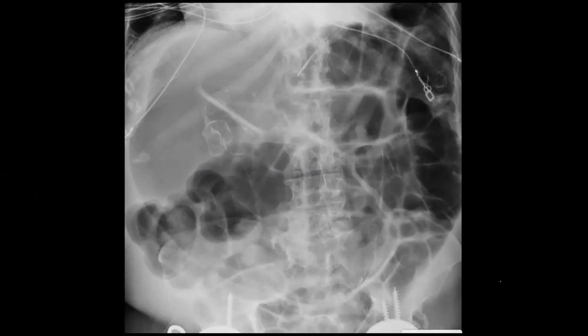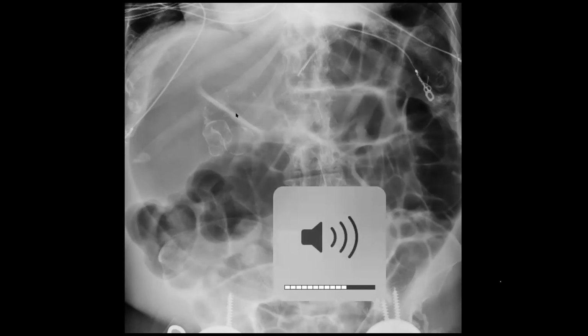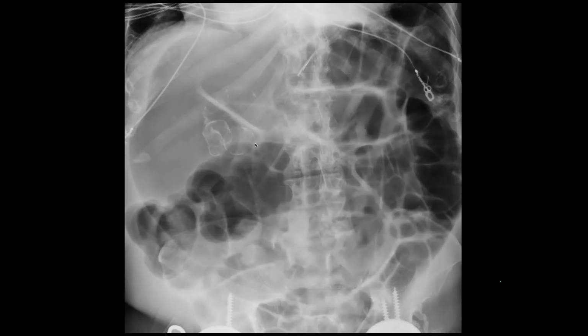Is there free air or is it just a giant cecum? It was just a giant cecum, so don't worry about the free air and don't worry about the bowel. There are these central, rim calcified things all across the abdomen, like right upper, left upper. Yeah, it was mostly up, right here. Upper. Yeah, and then Rubel is saying rim ovoid calcifications.